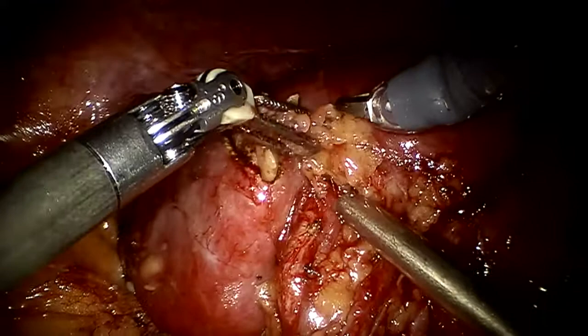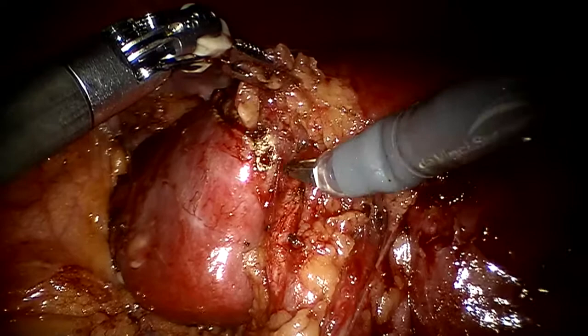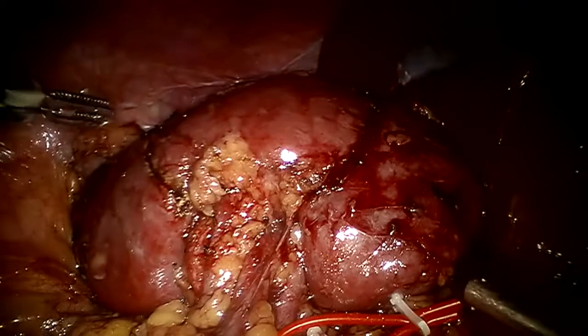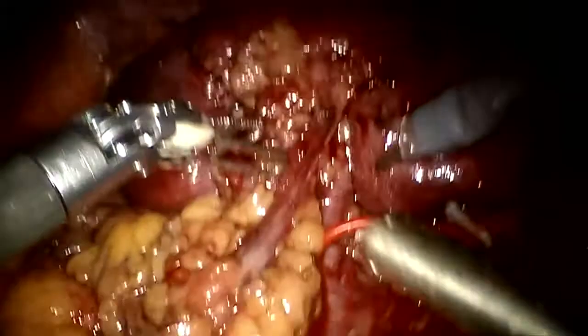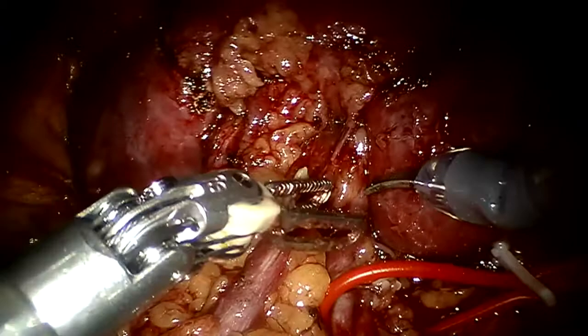Okay. So you can see this is where we have to take the kidney up to there. Yeah. So, I mean, this artery is going straight in there. But no reason for us to take it right now. We will take it a little bit inside, okay? So basically, this part of the kidney has to go. And let's see if we can dissect the vessels off the intrarenal part of the tumor. That's what we have to see.